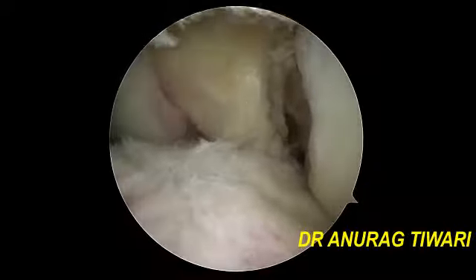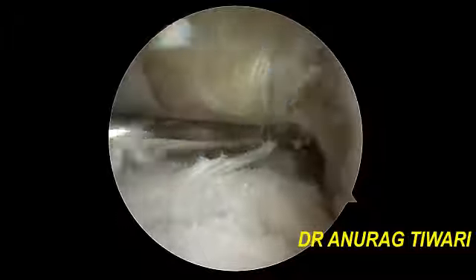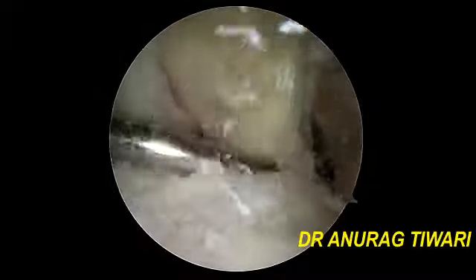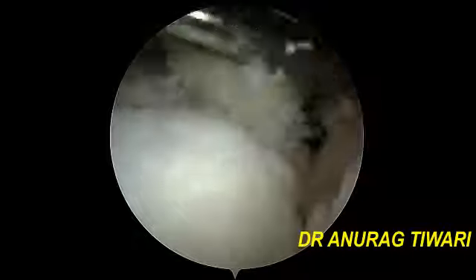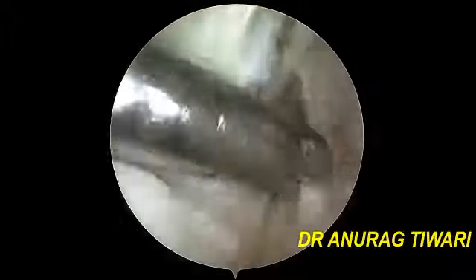On the posterior aspect is the PCL. These shiny fibers which you are seeing are the PCL. And the notch has to be clear before making any tunnel in the femur. So it is adequately debrided, and any remnant fibers have been cleared.